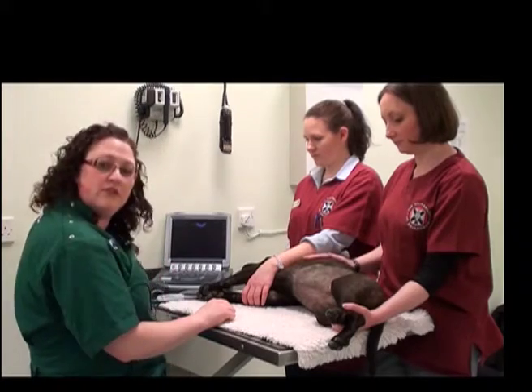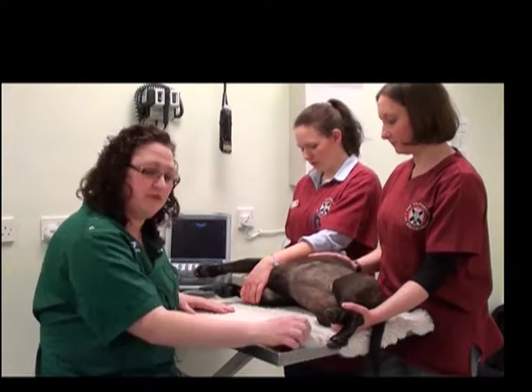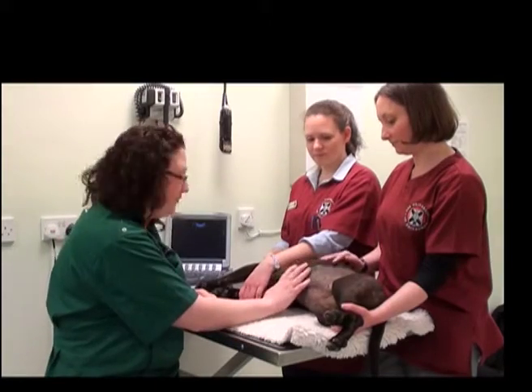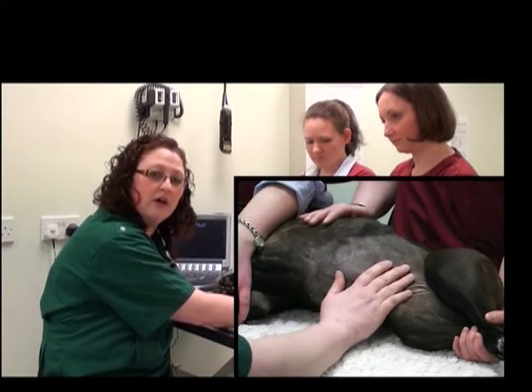Another important thing to do is to prepare your patient. This means placing the patient on a really soft surface, whether it's a vet bed such as this or a nice thick towel. It will really help her to stay comfortable. You also need to ensure that you clip a sufficient amount of hair away from the skin itself.